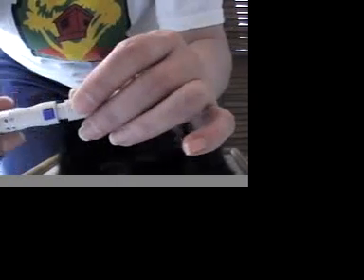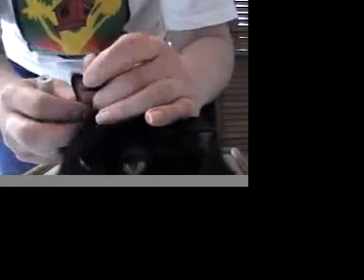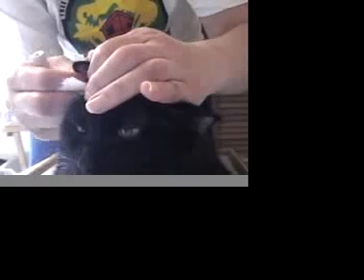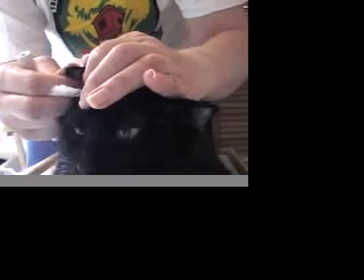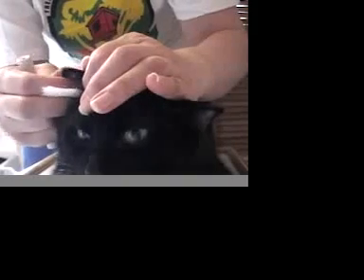Louie is what I call not a good bleeder — he doesn't bleed very easily from his ears, so I usually leave the depth set all the way to five. A lot of cats don't need it that high. I like to hold a little bit of cotton or paper towel behind the ear — that way if it turns red I know I went all the way through. I usually just warm his ear by rubbing it with my fingers, though some people like to use a sock filled with rice that they microwave.